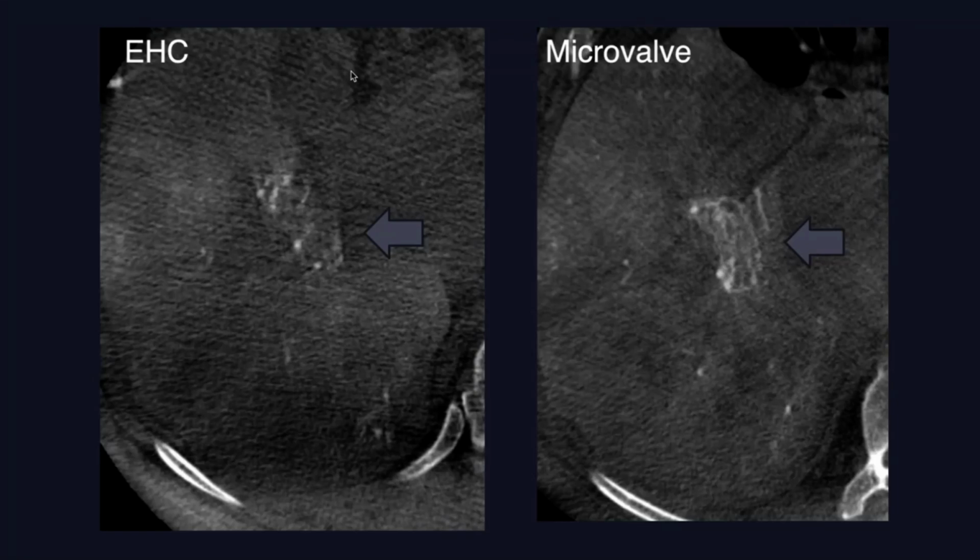And so here you can see we ended up using the larger size because, as you can see, the artery is quite large. And we repeated the cone beam CT 5-10 minutes later with the exact same parameters, and now you can see a marked difference in the tumor vascular uptake. I've really found it pretty helpful for these tumors where there are the threads and wisps of arteries where you really need to get more dose in. I found that pressure-directed embolotherapy really helps with these cases.